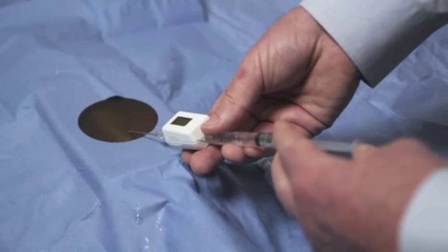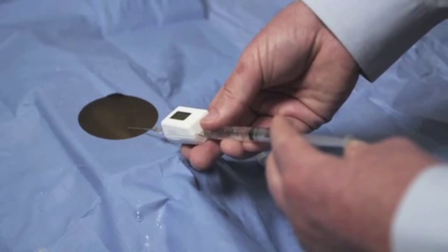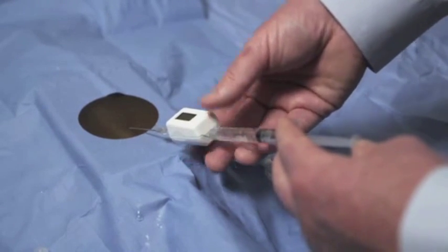Depress the syringe and inject roughly 0.3 cc of saline to ensure there's no subcutaneous tissue blocking the needle tip.